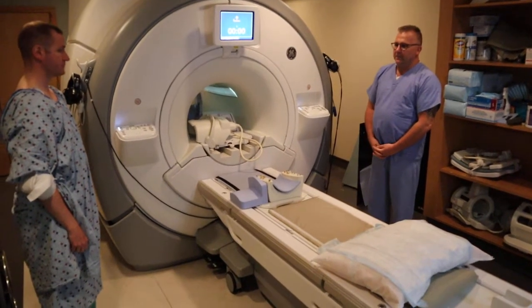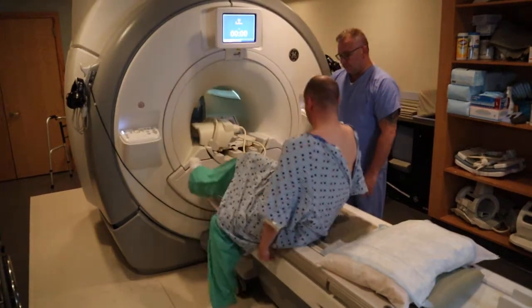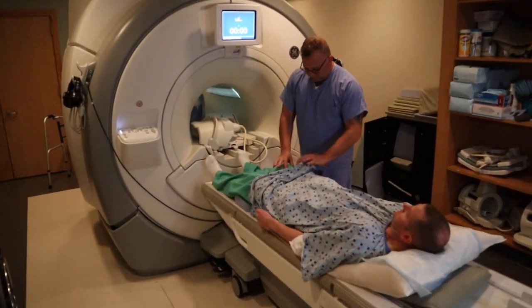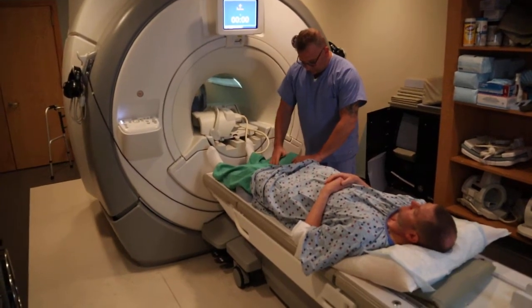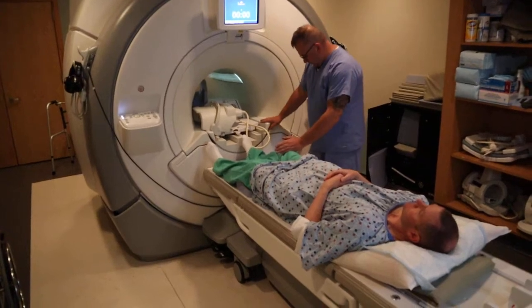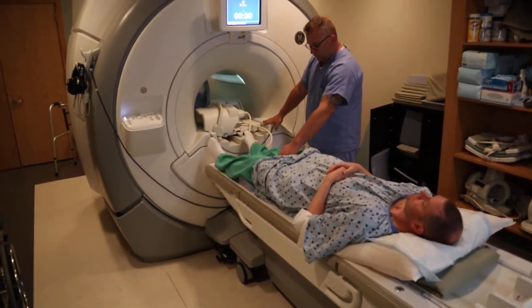We're now going to position for an MRI of the knee. The patient is going to lay flat on their back and their knee is going to be placed within the eight-channel knee coil. In some cases the knees might be too big — whether they're post-op knees or maybe an injury — you could also use something called a quad knee coil, which is a little bit bigger.